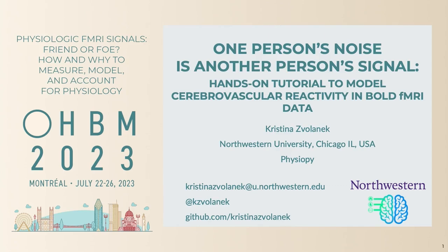Hello, my name is Kristina Zvolanek, and I am presenting a hands-on tutorial to map cerebrovascular reactivity as part of the OHBM educational course on physiologic fMRI signals.